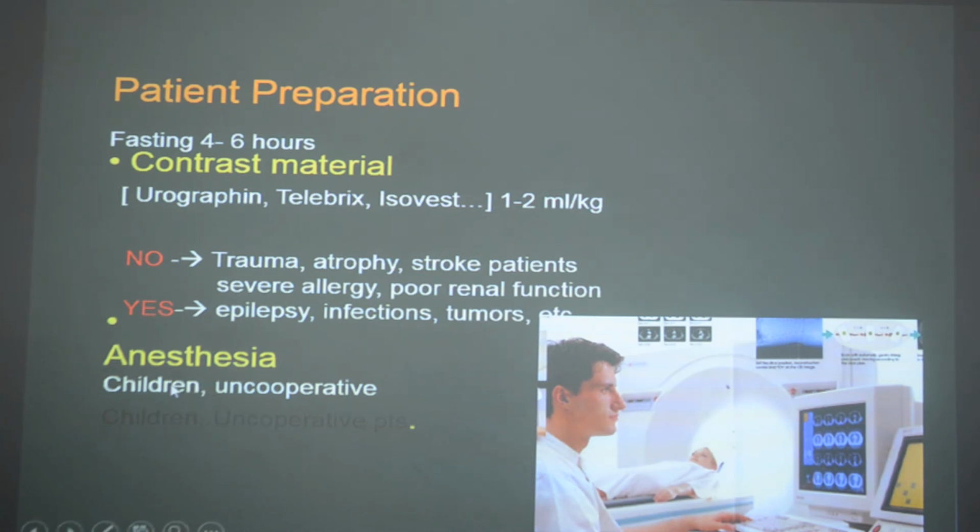So this is only for CT, right? Only for CT, not MRI. Yes, we are talking about iodine at the moment. Contrast media also holds for infection and tumors in MR, but obviously the contrast is different. In MR, the contrast is gadolinium.